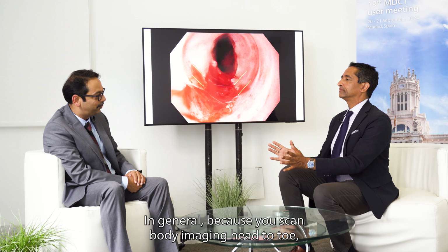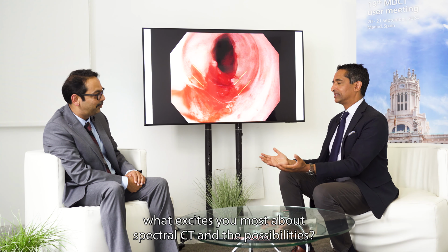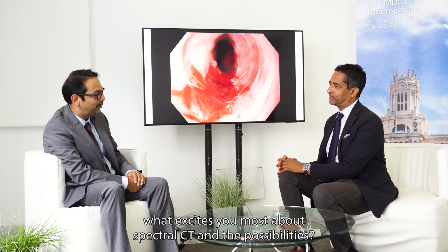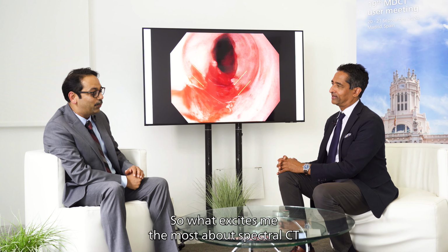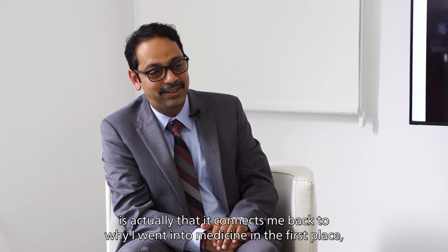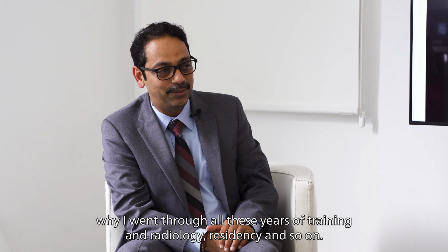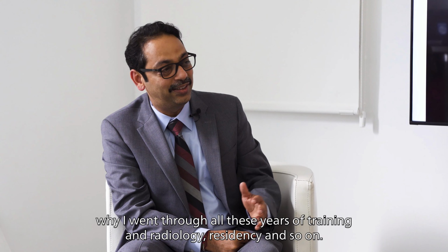In general, because you scan body imaging head to toe, what excites you most about spectral CT and the possibility? So what excites me the most about spectral CT is actually it connects me back to why I went into medicine in the first place, why I went through all these years of training and radiology residency and so on.